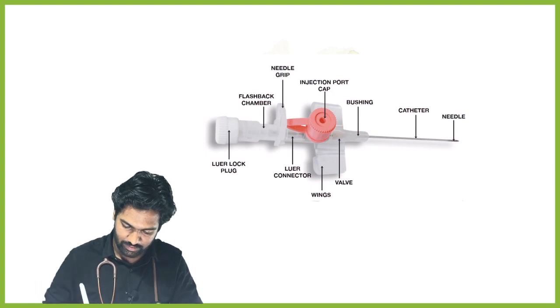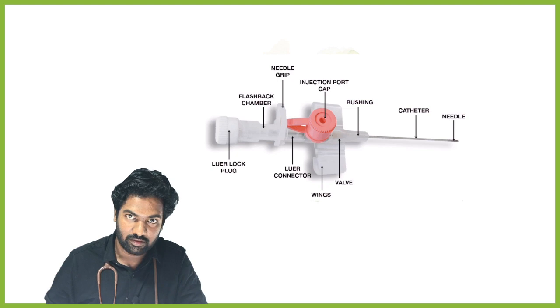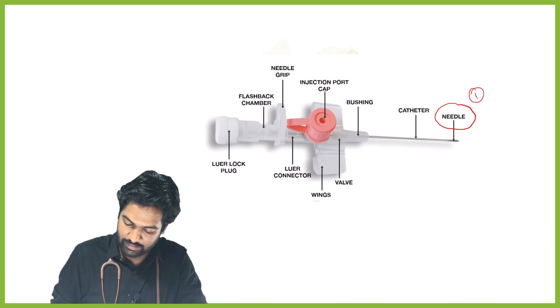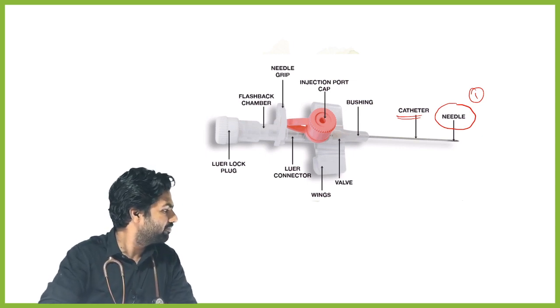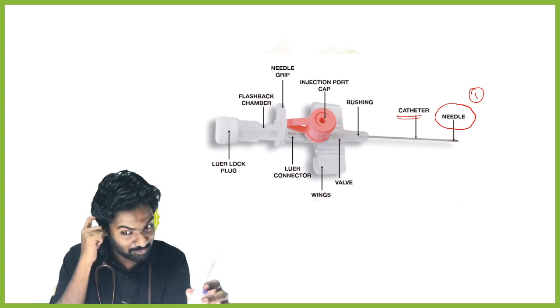You can see here this entire IV cannula I have put on the picture. Is it visible? This has the needle and the catheter. This catheter actually runs. Wait, I shall open it. Opened here.